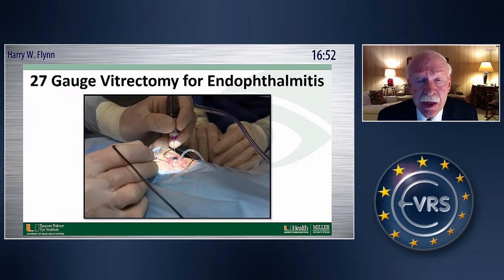After that culture is obtained, we continue to remove as much of the formed vitreous as possible. This procedure should take approximately 10 minutes. It does not require aggressive compression of the inflamed vitreous space, but rather at the core we can remove the vitreous opacities. Next slide, please.